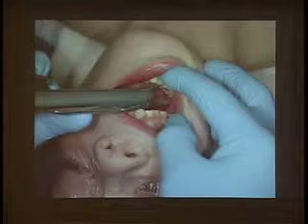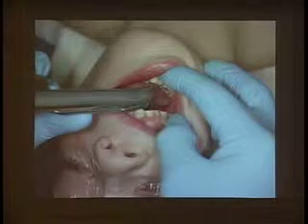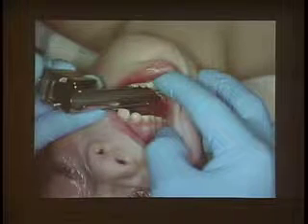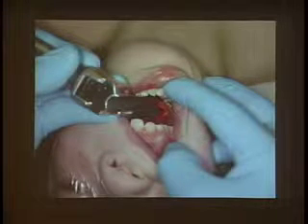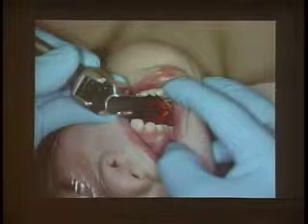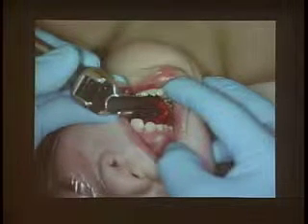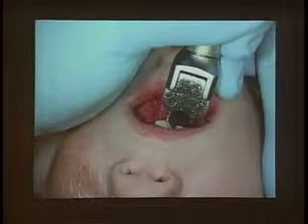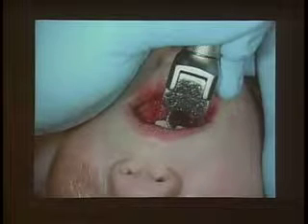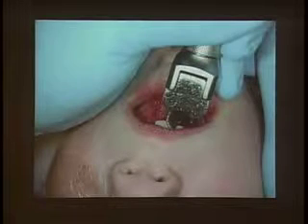So, sure, I'm exaggerating here for my trainee. I'm actually turning the blade because I have the room. But if there was micrognathia, a small opening, you would be lucky if you just jiggle it in, okay? And I'm heading over to the right side. And notice, if you can, you're all at the head of the bed. The tongue is now going to be way up at the left, up against the palate. That's where it's going to end. I have two sets of series, okay? And it's dark, but if you really look here, you can actually see the vocal cords right there.